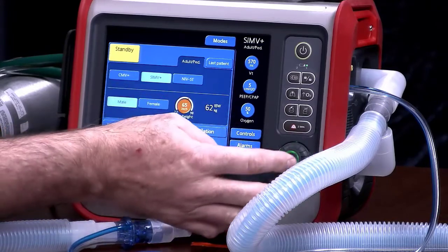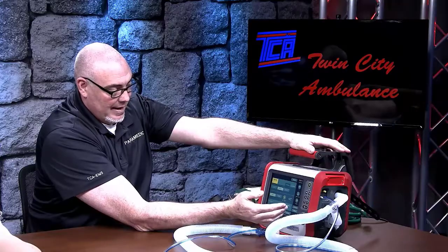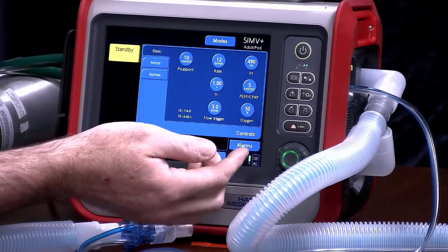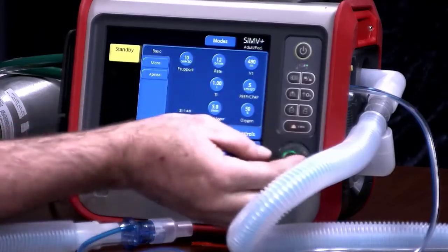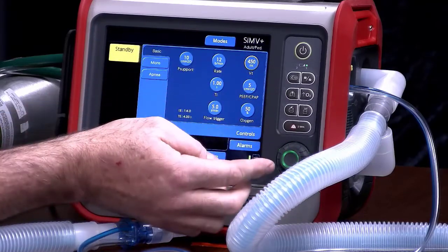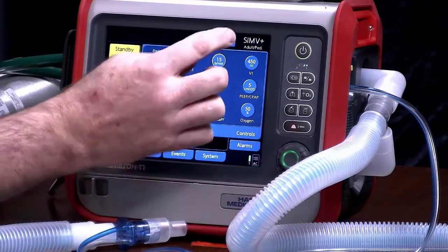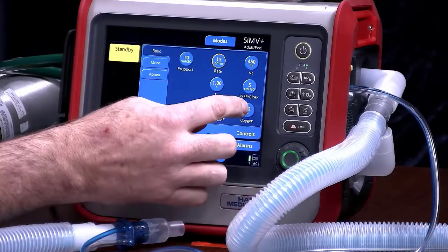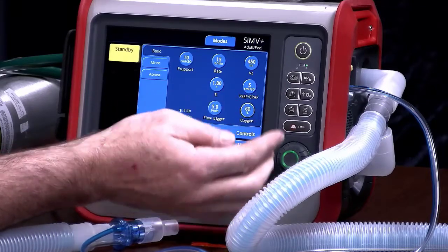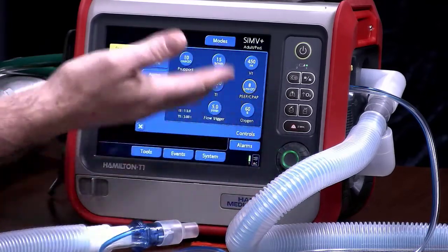When you're done, you can either push the knob or re-click the screen. I've selected SIMV+ and can now go into my controls to match the settings at the hospital. Let's say our patient has a tidal volume of 450 — click on tidal volume and drop this to 450. Let's say a breath rate of 14 per minute — set that for 14. If the FiO2 is 60%, set that. And let's say the PEEP for this patient is 8 — set for that. So we've got all of our settings matched.